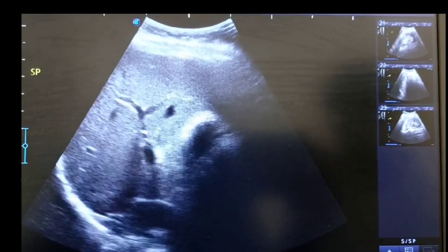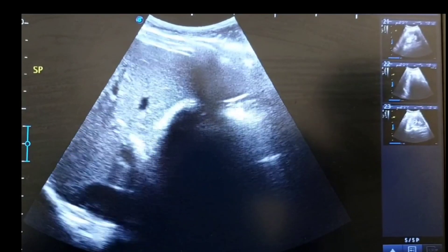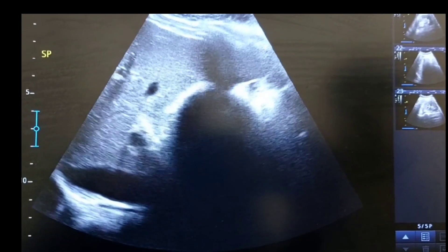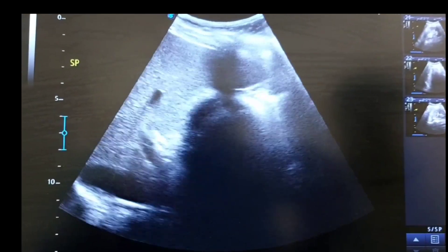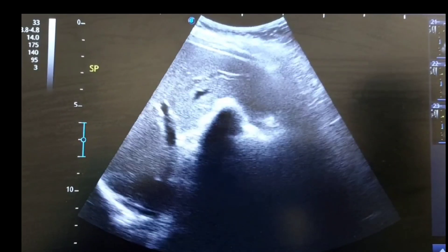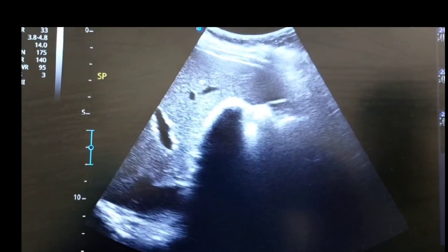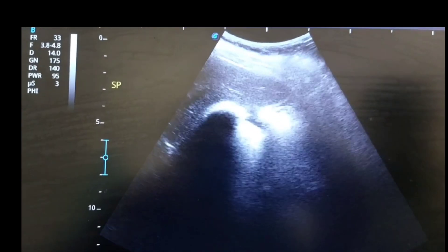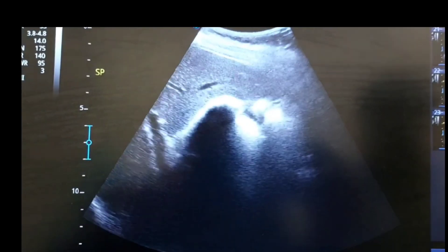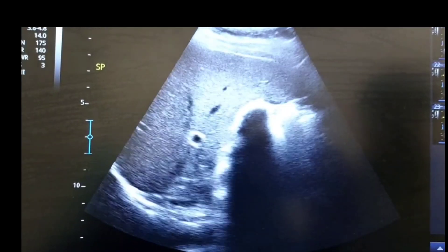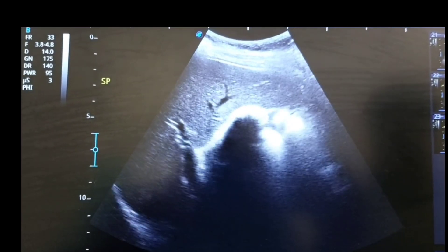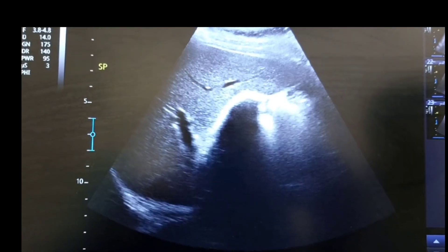On this ultrasound image you can appreciate what porcelain gallbladder looks like. Even if you haven't seen this image before, you might be confused about what it is and where the gallbladder is. This calcification is entirely obscuring the gallbladder appearance, and you can see this acoustic shadowing obscuring the entire lower structure — you can't see the CBD or even part of the portal vein. This is how porcelain gallbladder appears on ultrasound.